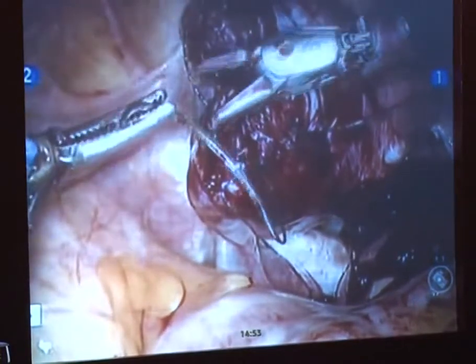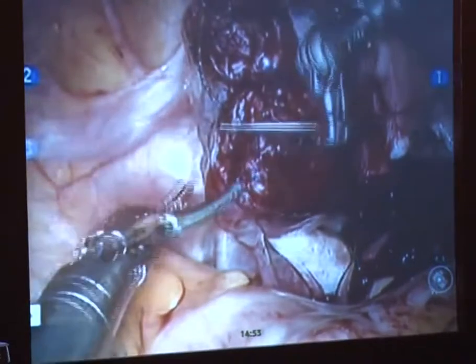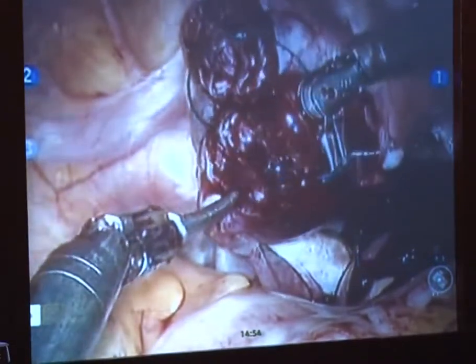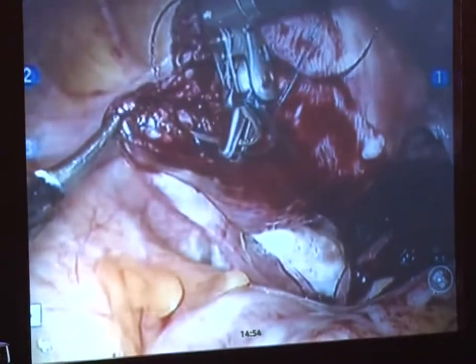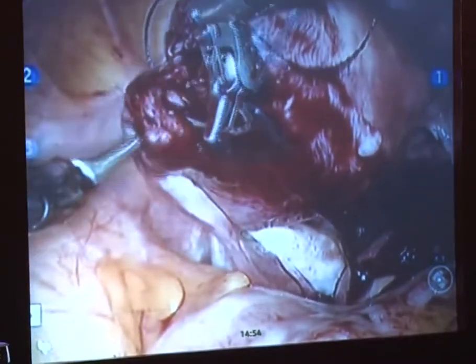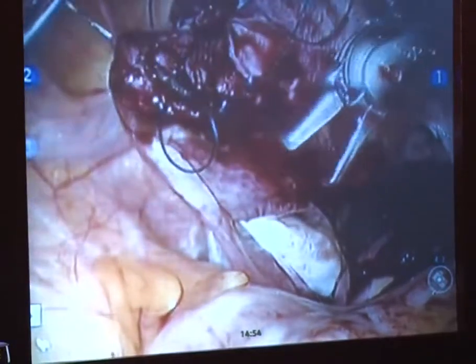Just want to make sure I don't take too aggressive of a bite here because I'm near the tube. We don't want to compromise the tube here. So I'm staying away from the tubal origin, staying only in the muscle here.